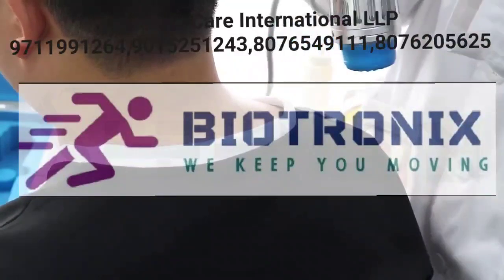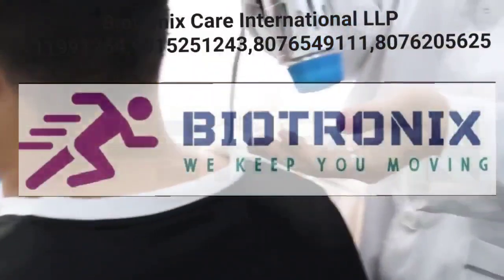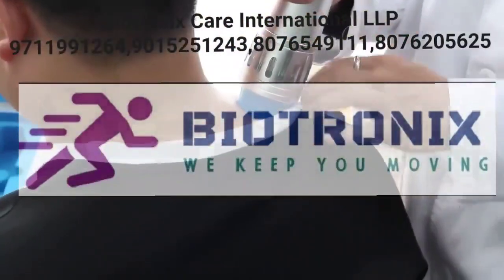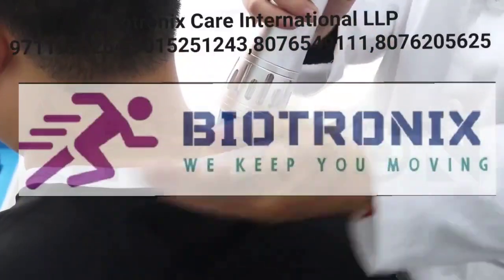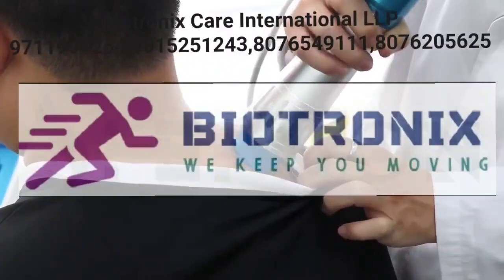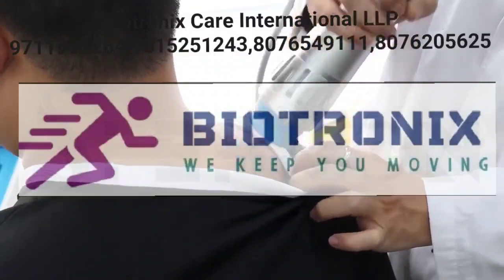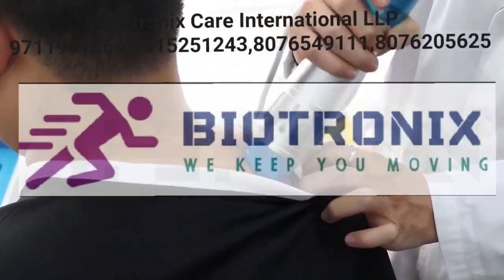You can do the operation over here. So it can mostly do the massage on the body. Of course, it can do the massage on each area of the body. This is the point time treatment, and this is the rotate.